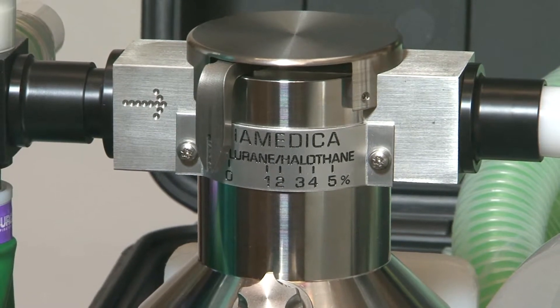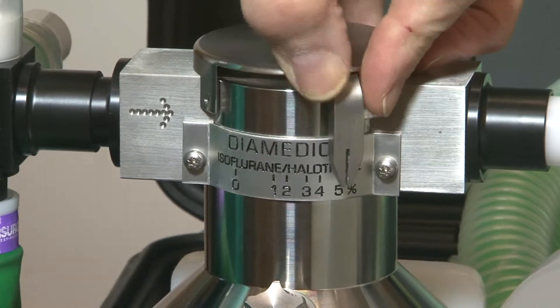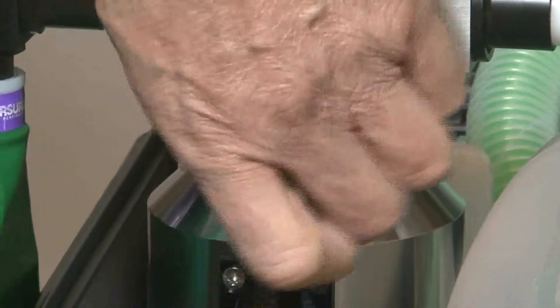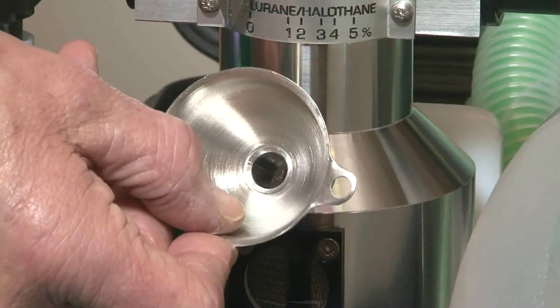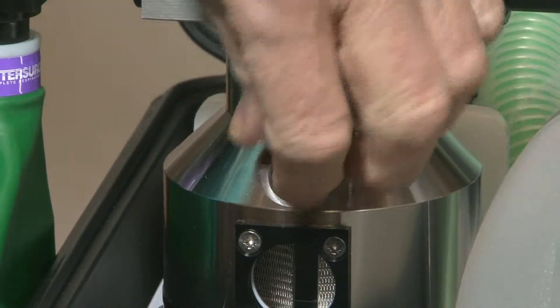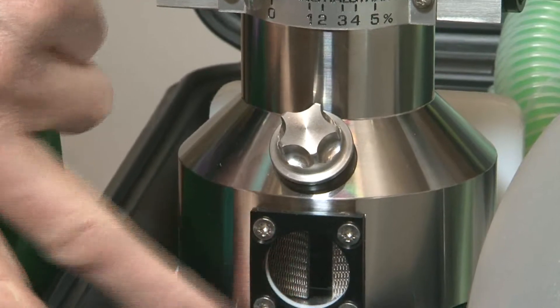The isoflurane halothane vaporizer is calibrated for either of those agents. The scale runs from 0 to 5%. It is filled by unscrewing the cap and using the funnel supplied. The vaporizer can hold up to 150 ml of anaesthetic agent and the level of agent should always be visible in the sight glass.